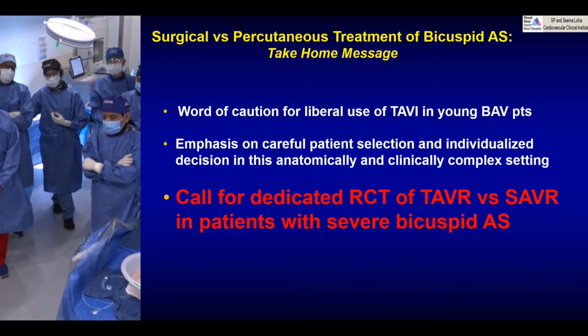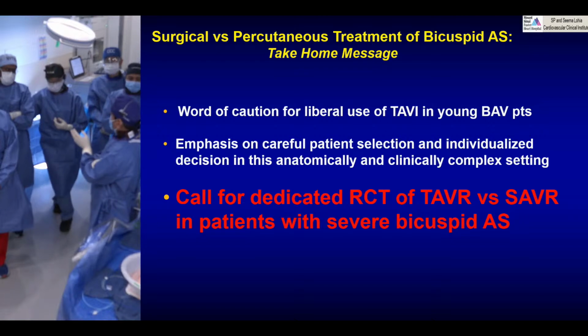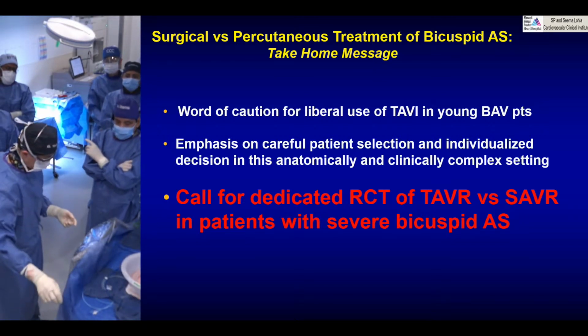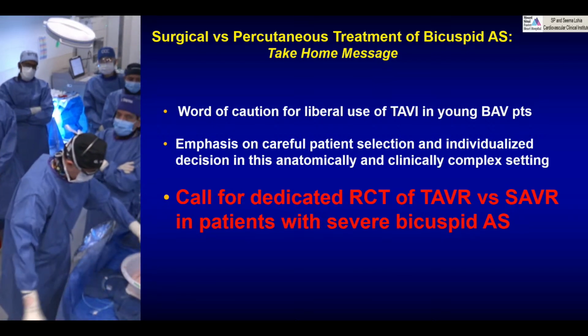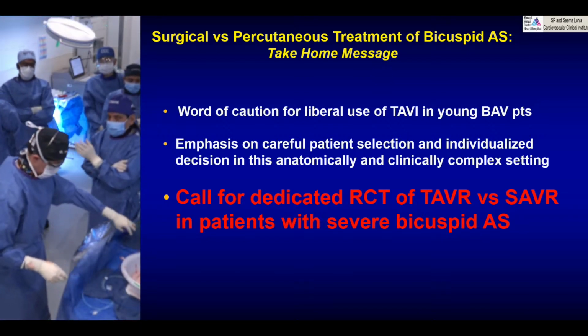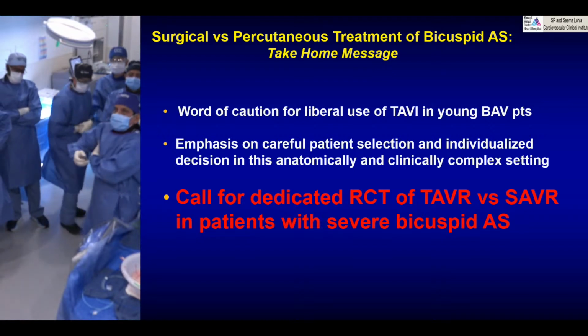Yeah, actually Raj Makkar is taking the initiative. He has sent a review asking people. So should there be an age limit for that? That's another point. Should there be an age limit cutoff? Should it be 65, or can you go lower as long as there is no significant aortopathy with this bicuspid valve? So I think all of this is being planned. Whether it will go to the final randomized trial remains to be seen.